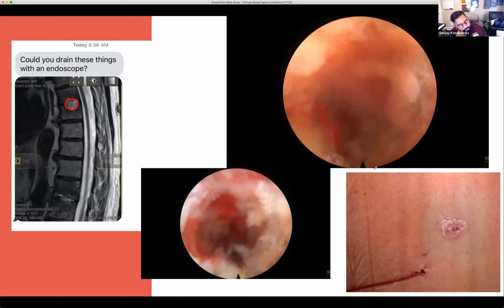Yeah. So, there's some studies coming out. I think the last one I read was a few months back about the issues and complications of irrigation. I think it was primarily due to the lumbar spine. They were talking about increased incidence of seizures from this. It's tough to say. I don't make any particular changes to the type of irrigation that I do for thoracic versus lumbar cases.